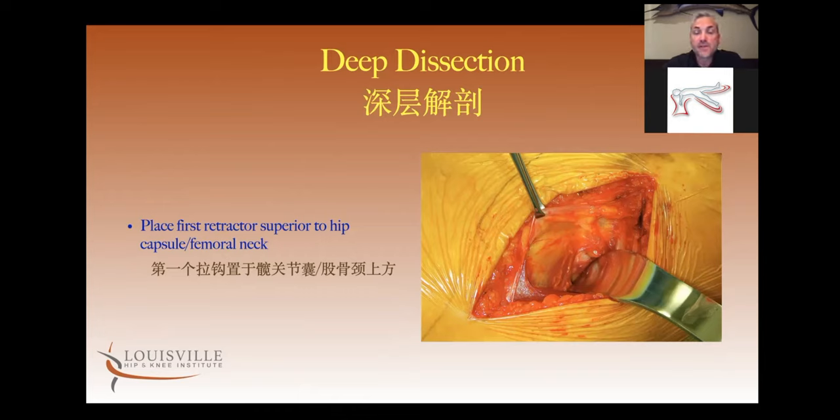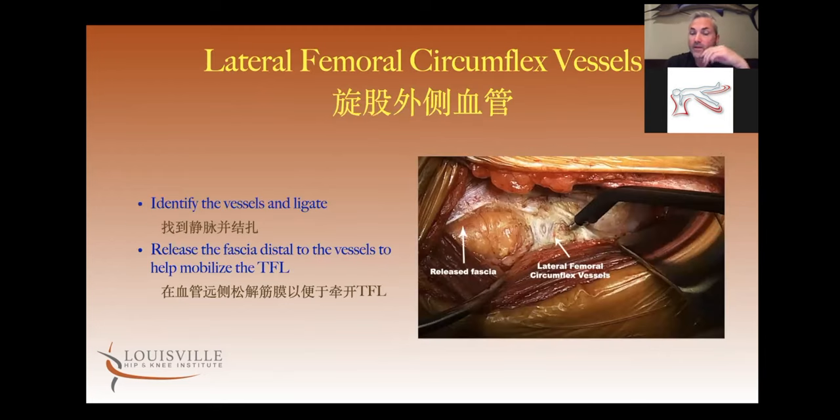I develop a little pocket over the superior capsule with my finger and drop a retractor over that superior capsule. Then I put a self-retainer — for me I like a Gelpi — into the interval. On the right you see the retractor over the superior neck, on the left you see the arms of the Gelpi. Now I'm looking for the lateral femoral circumflex vessels.